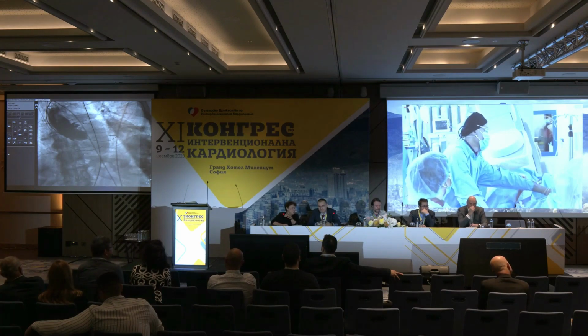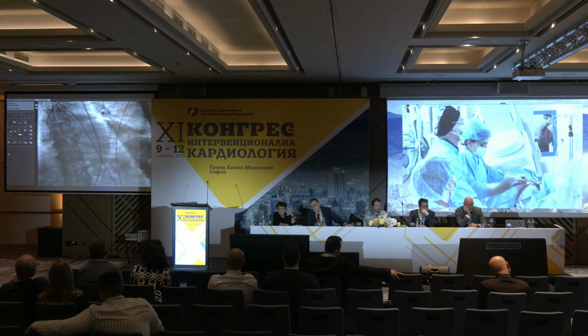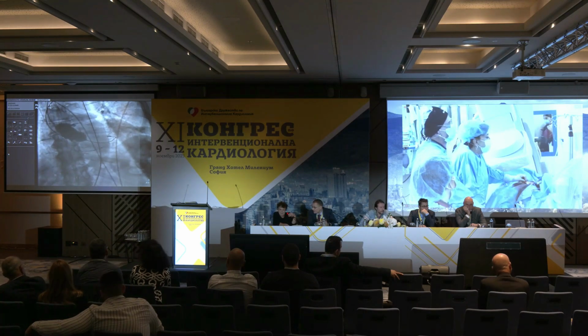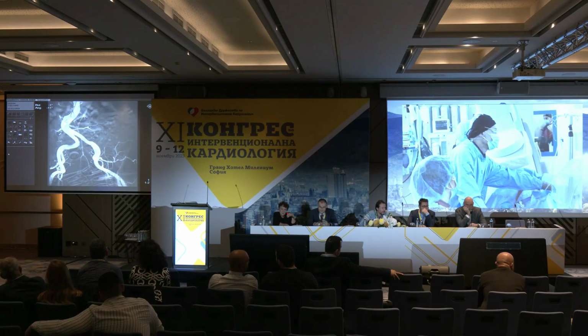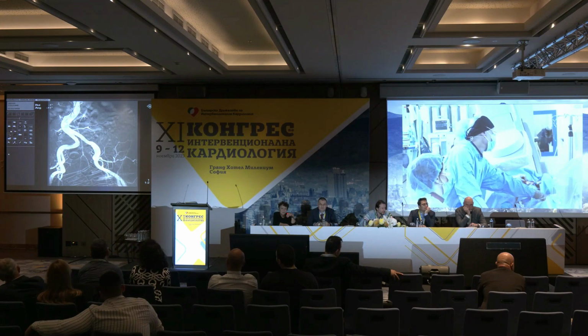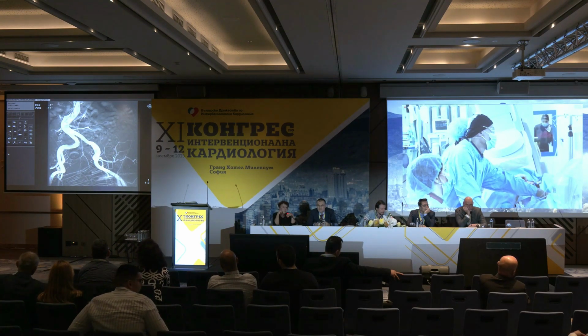So the first step, you usually use roadmap for the femoral puncture. So you can see the very tortuous segment of the aortoiliac segment. So we decided to go to the left femoral artery.